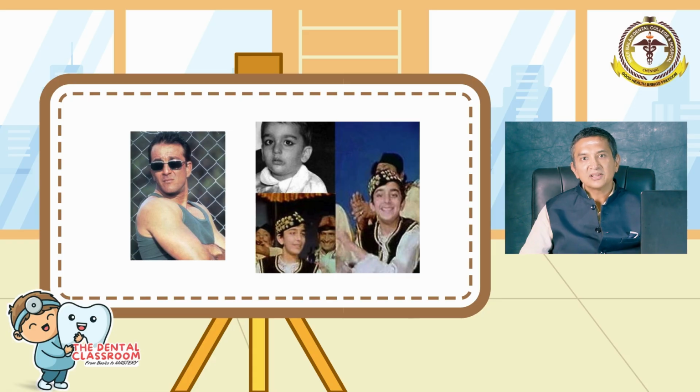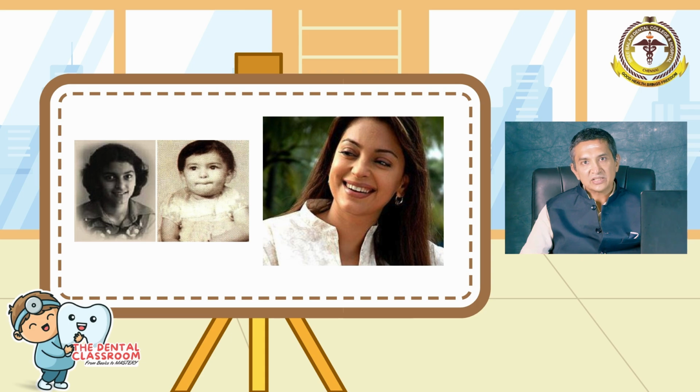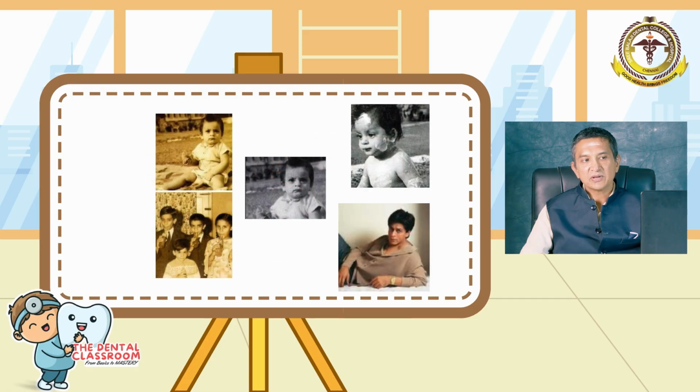I am sure all these pictures which you see in the slide are of famous cinema artists, and you can predict how they will look at the age of 18 or 20 or 22 as the case may be with cephalometrics. If you can take a cephalogram of all these famous stars at the age of 7 or 8, it will be very easy to predict their growth and development.